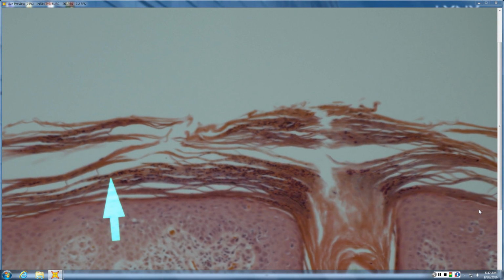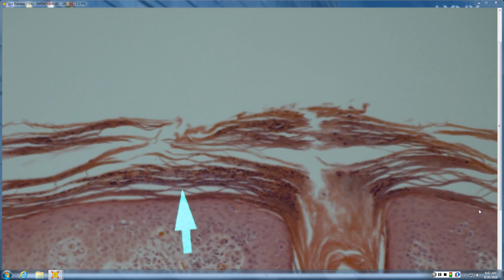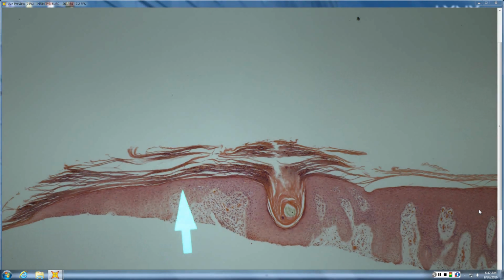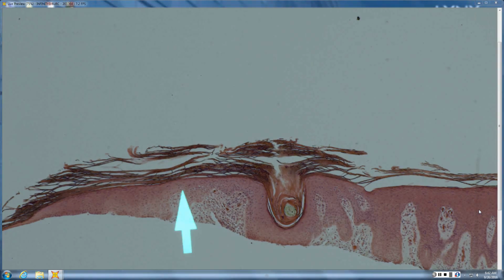But as you guys also probably know, that really brings up a differential. Lots of things can look psoriasiform. And anytime you see neutrophils in the horn, that's where you want to think of that PTRIBS differential. That's the way I memorized it: psoriasis, tinea, reactive arthritis, impetigo, candida, syphilis, sebderm. You want to think of all those things because they can all look very similar. There are some subtle clues that help you tease that out, and that's what we're going over today. But generally speaking, if you see neutrophils in the horn, you have to consider all those things.